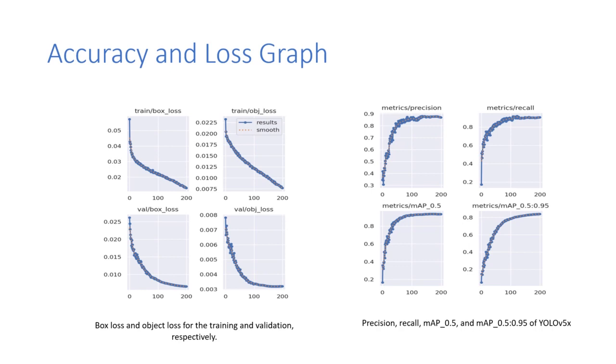Additionally, we will examine key metrics including precision, recall, specifically for YOLO V5X. These metrics offer a comprehensive evaluation of the model accuracy, sensitivity, and performance at various thresholds.